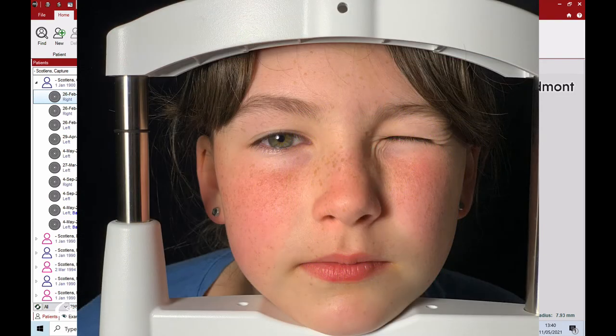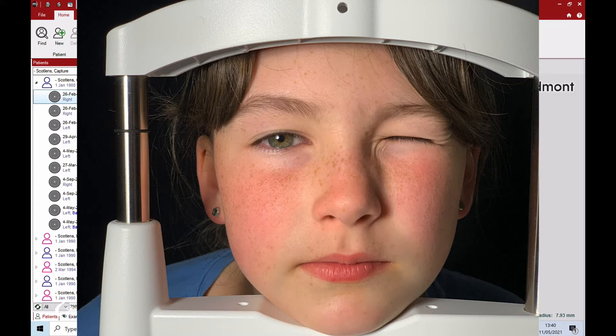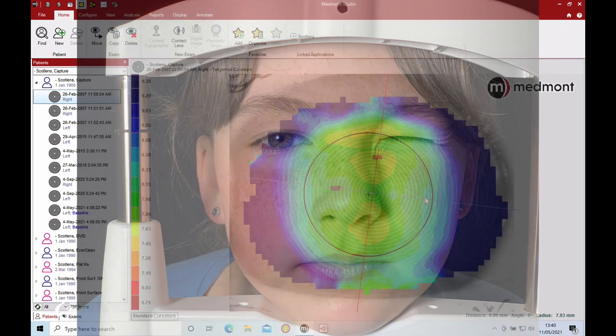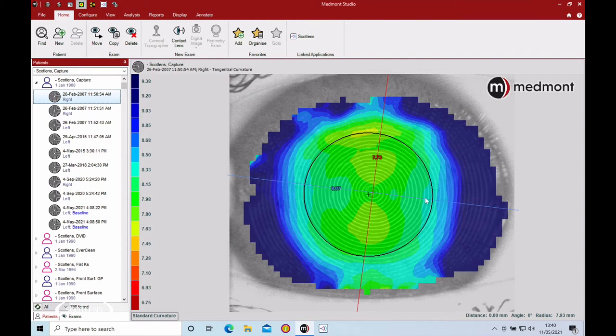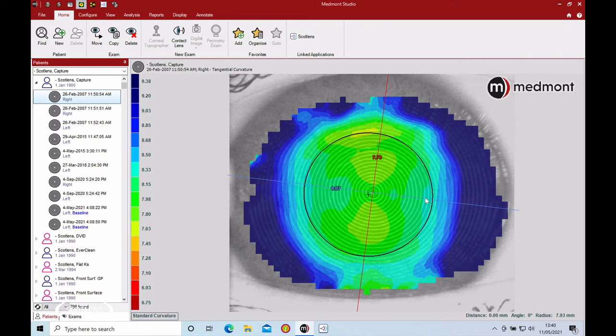Ask them to keep both eyes wide open. If a patient's got one eye shut to try and concentrate, it tends to close the eye that we're trying to capture. So turn your head, both eyes wide open, take a few blinks, and then try and capture the topography.